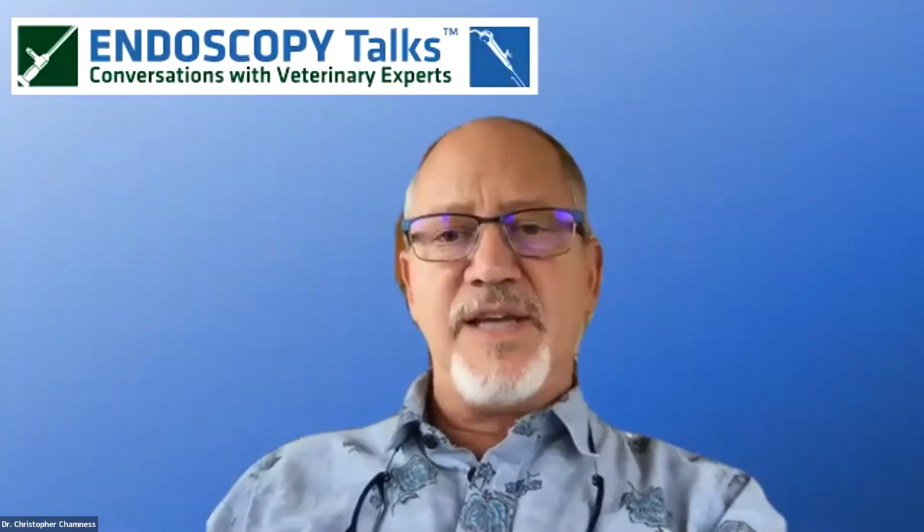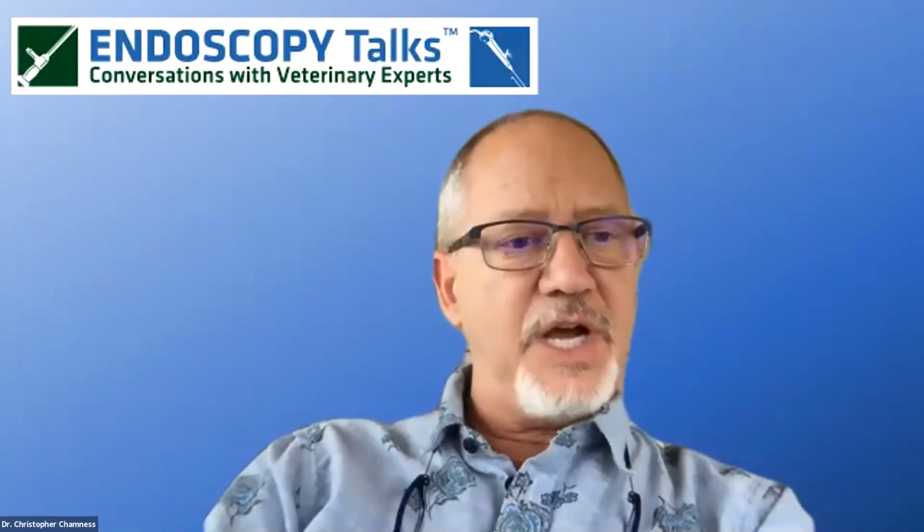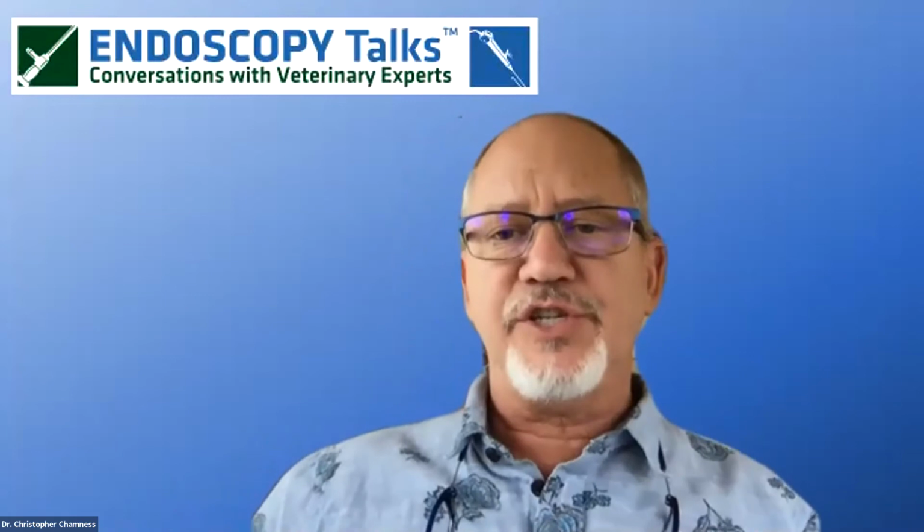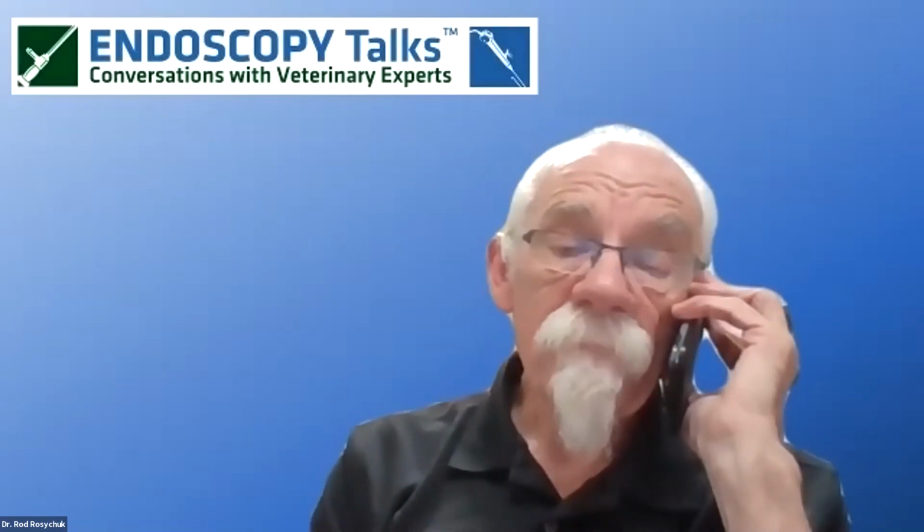Okay, I've got several more questions for you, Dr. Rosychuk. First, do you ever use local nerve blocks of the greater auricular nerve when performing procedures in ears? The answer to that question is yes, we do routinely. Anytime we are going to be working in the area of the tympanum in dogs and cats, we'll routinely block.